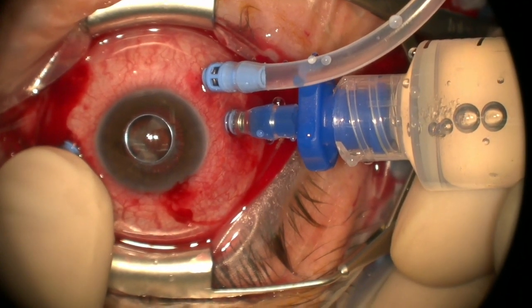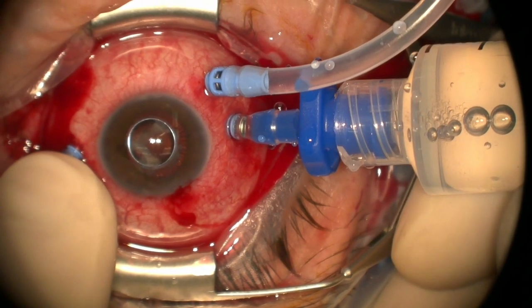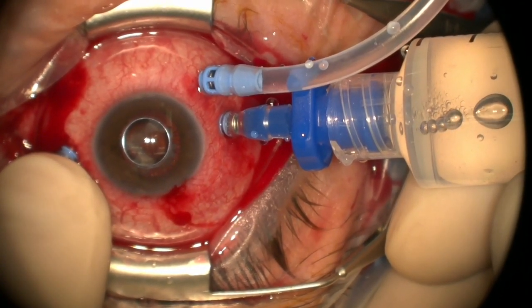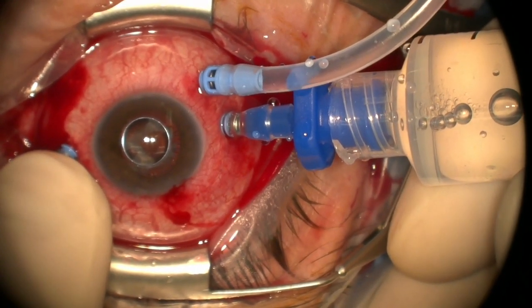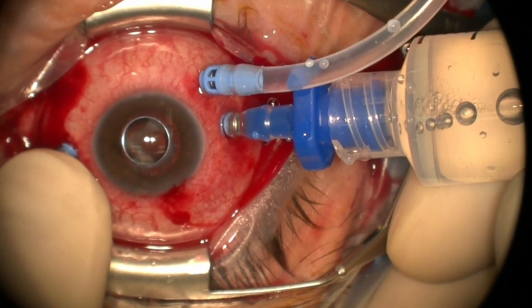Well, we don't know. We're going to find out on the vision. So Eric just asked how much damage is done. And the thing in this type of eye, it's very hard to predict what our final vision will be. I think you're looking at this surgery, Eric, and then letting the eye heal. Then ultimately a lens implant will be needed yet.